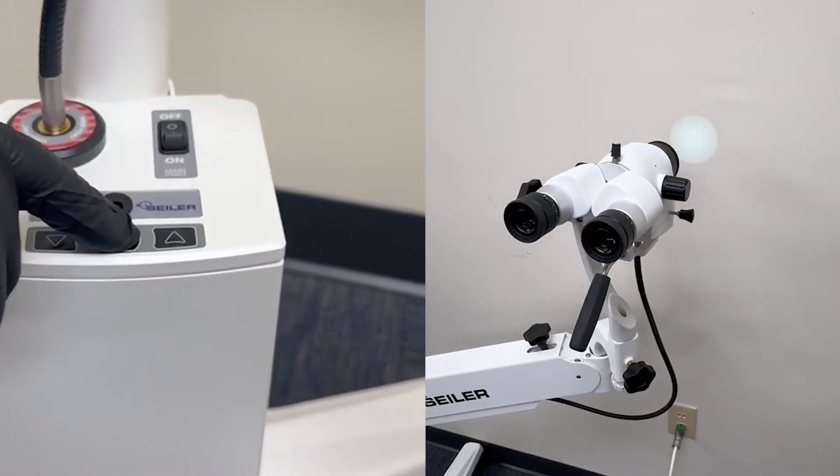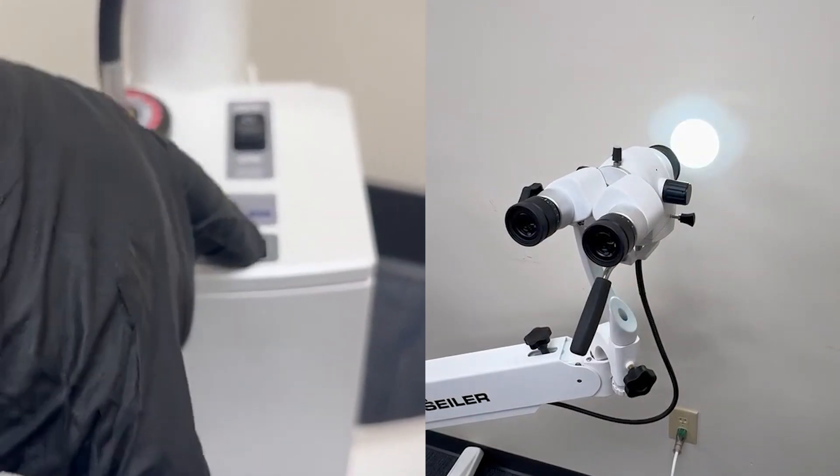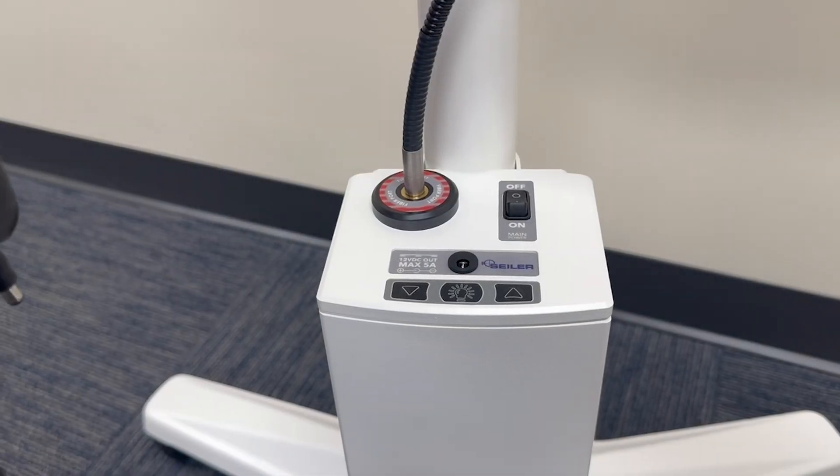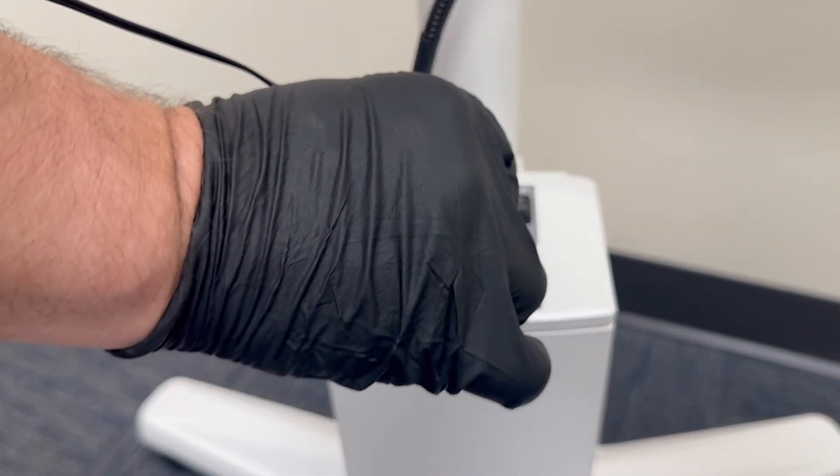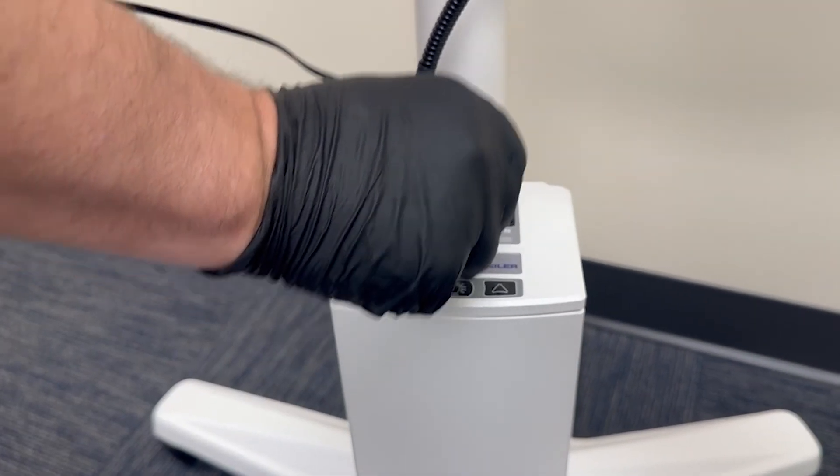Siler sets the gold standard in medical illumination, boasting an impressive illumination intensity of over 100,000 LUX through its LED light source. Siler Colposcopes come equipped with a 12V power source, which allows for the integration of a camera's power directly into the Colposcope.